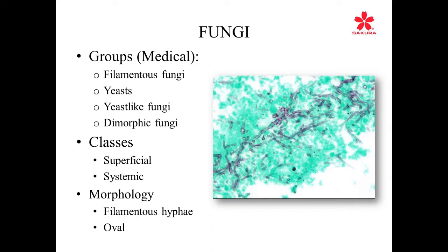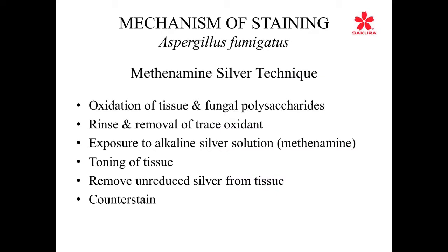And the nucleus of that parent cell will divide, and one of the nuclei will migrate to the bud section. And then the cell wall will come down, and actually the bud will separate and break away. So this is the method of reproduction that we see in budding. And so when we look at the morphology of fungi, we will see that phenomenon here.